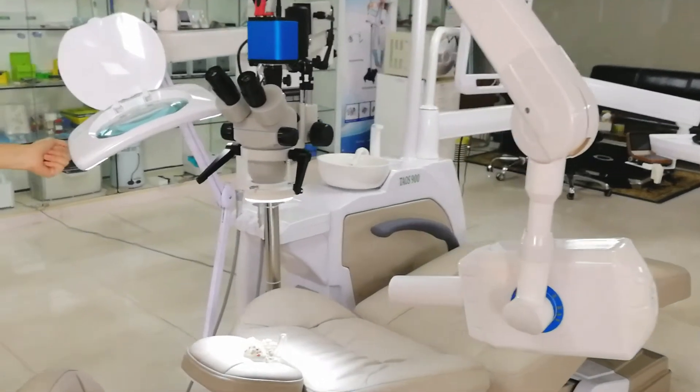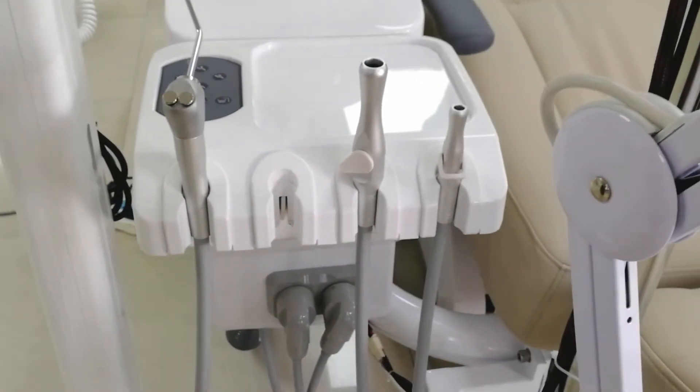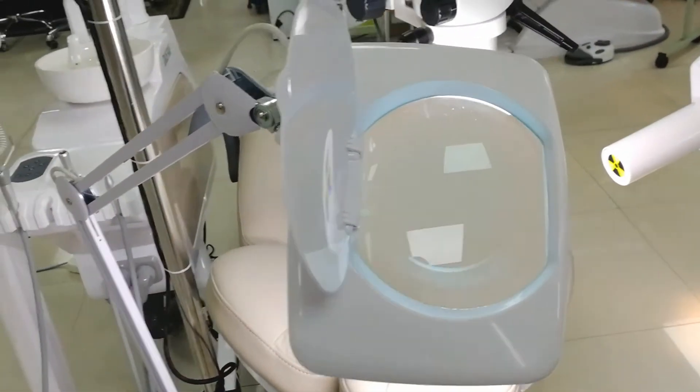This chair comes with a built-in direct electric suction. No spittoon-style bowl. Normally, the spittoon-style is a source of infection. And we also install 3D goggle loupes.